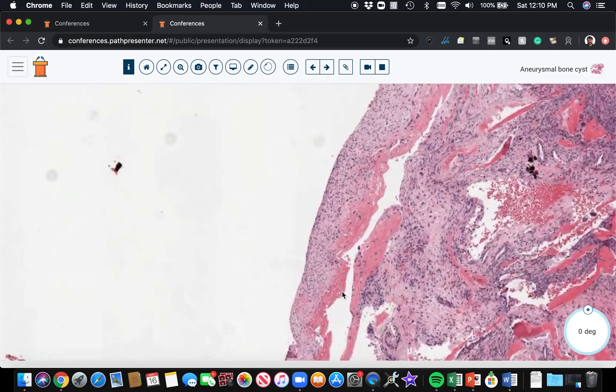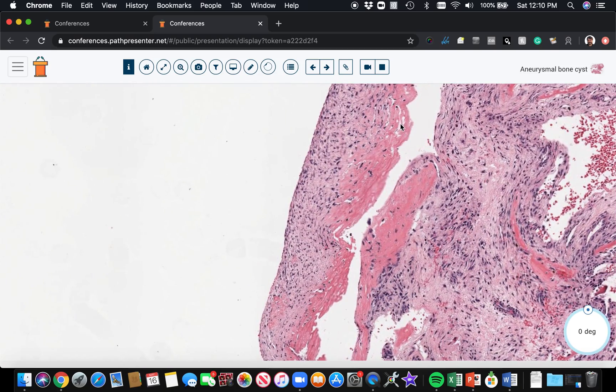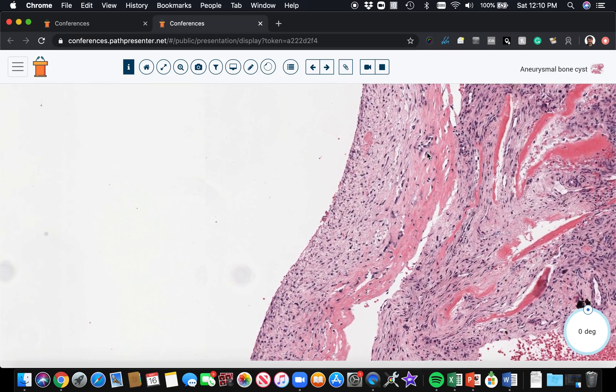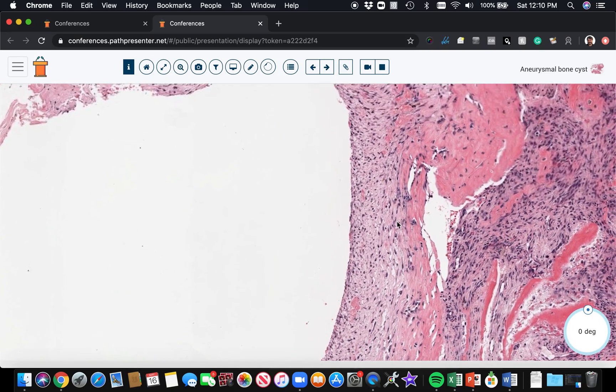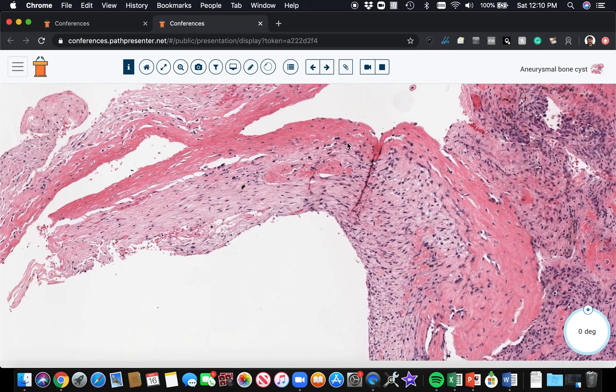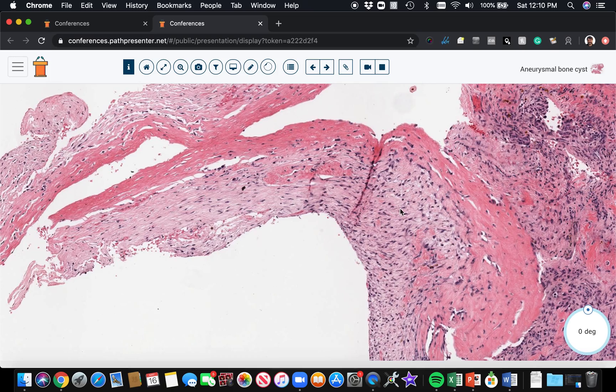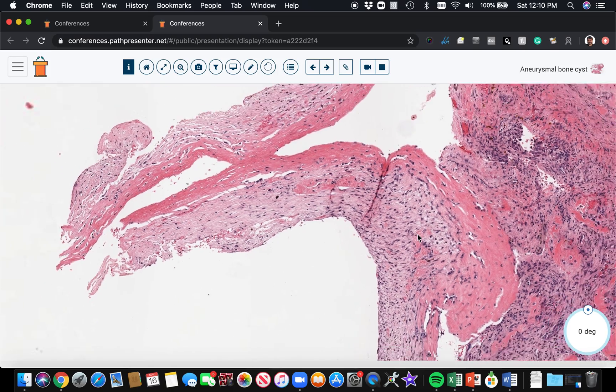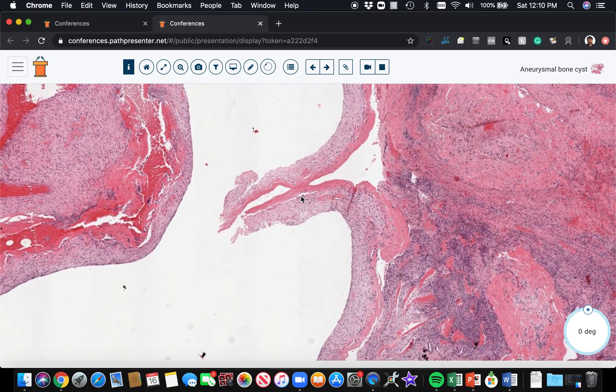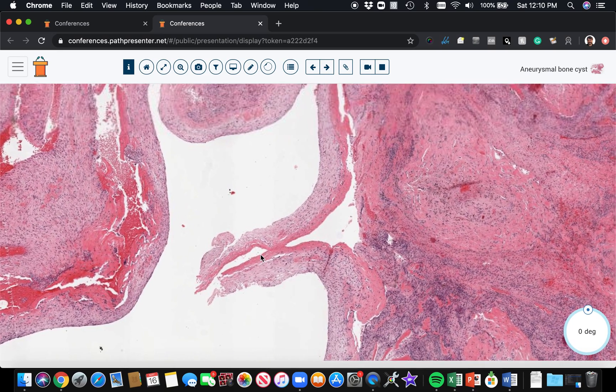See here we've got this like strip of osteoid, of bone production here that's being laid down right along the septa of this cyst lining. So in between the cysts you have these septa.